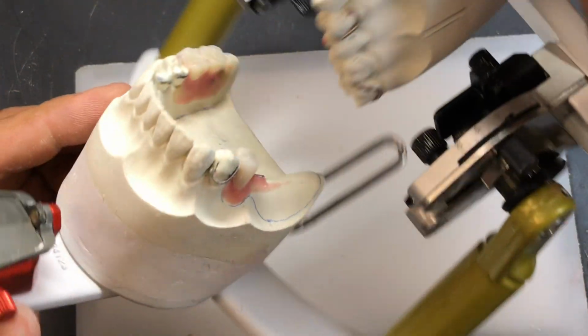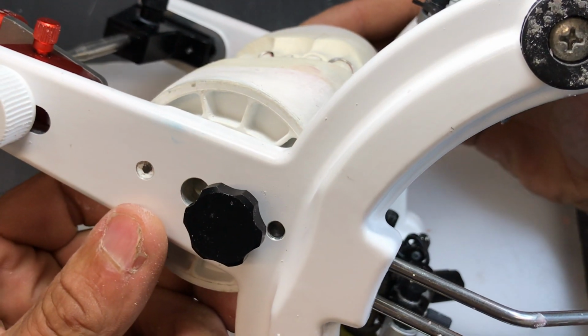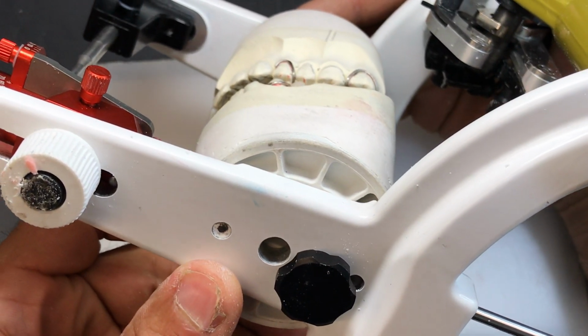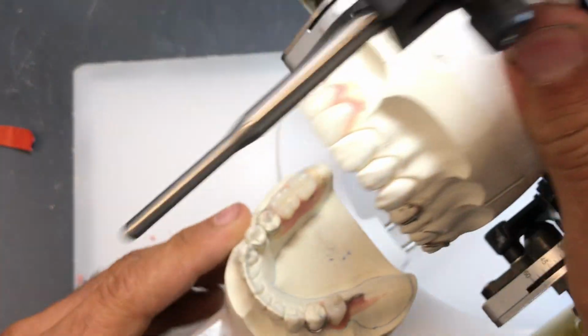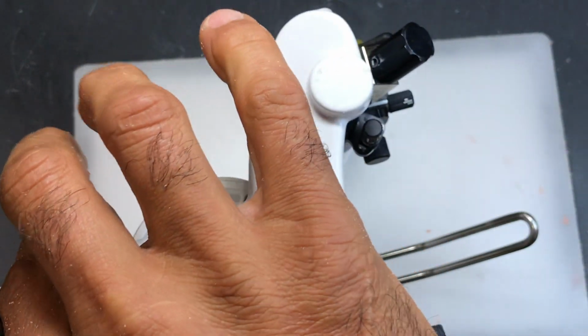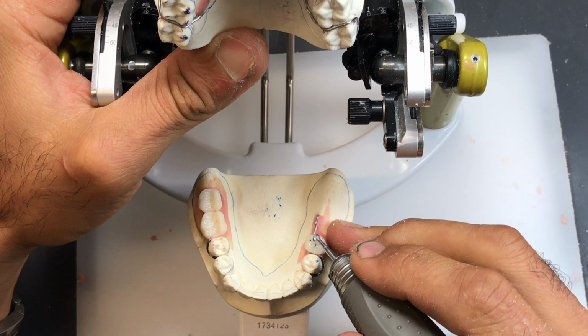So I'm going to go back. Well, that's pretty close. Buccal overjet looks good. It looks like the buccal cusp tip is falling to the upper central fossa. So feeling good right now. Let's do that one more time. And again, there's a bit of a distal contact here.